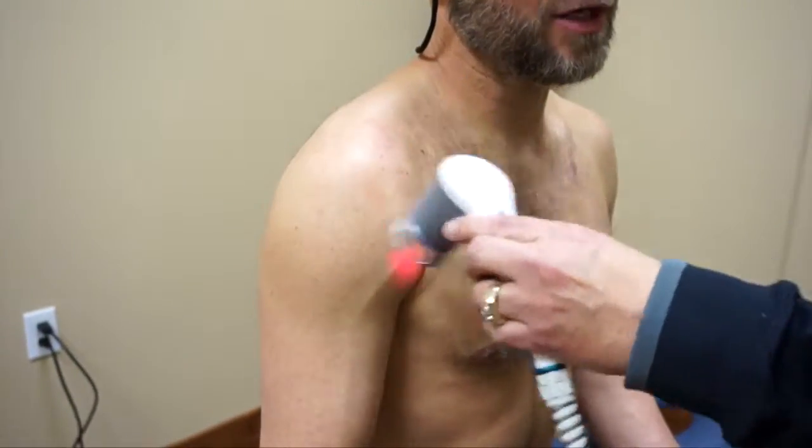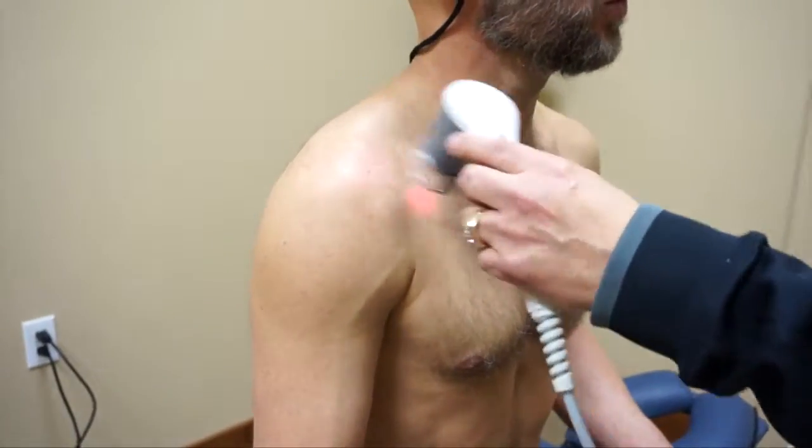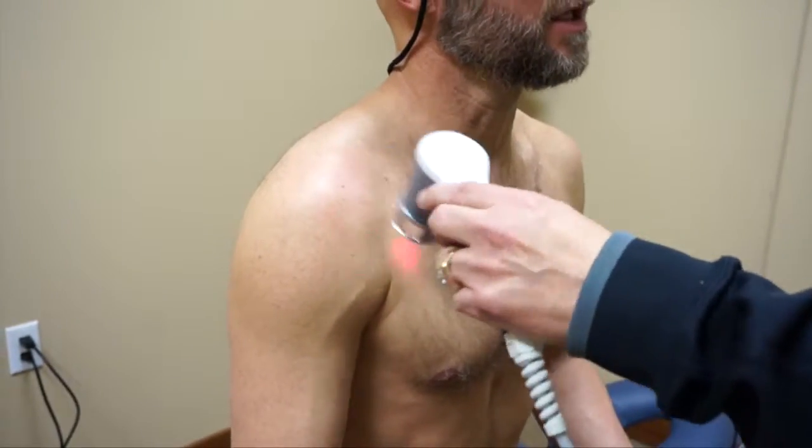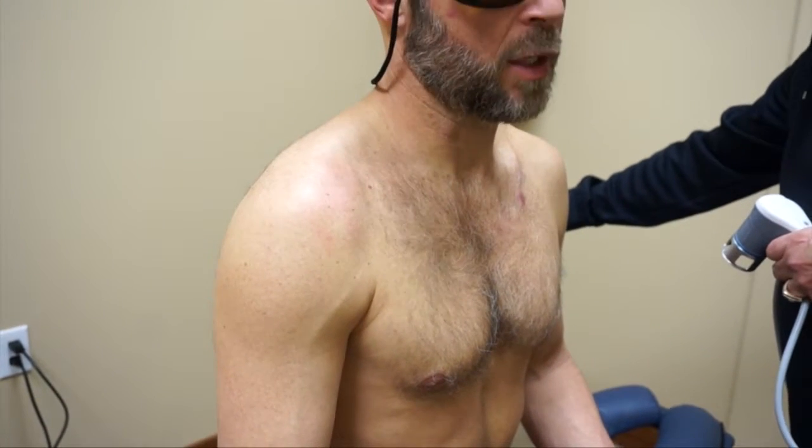Would you use higher wattage — say 60 watts — in more dense tissue like the quads or glutes? You can do it, but it comes down to patient tolerance. It just goes up in terms of how much heat they experience.